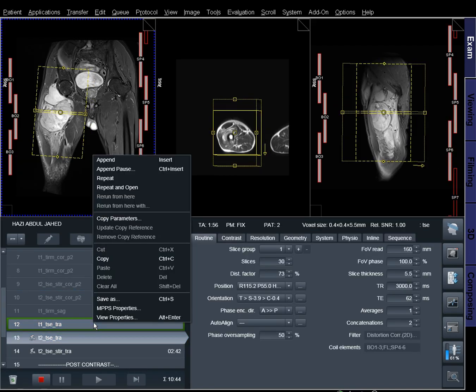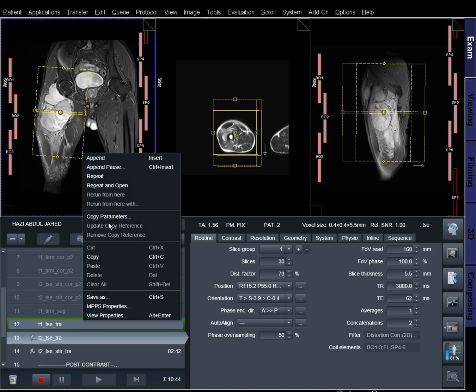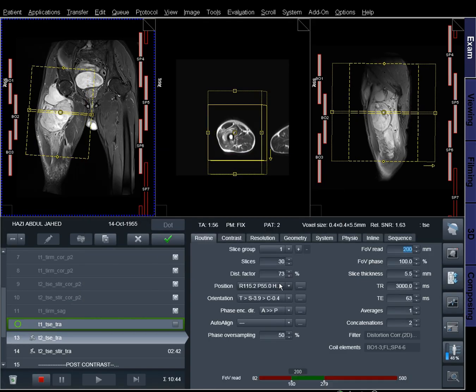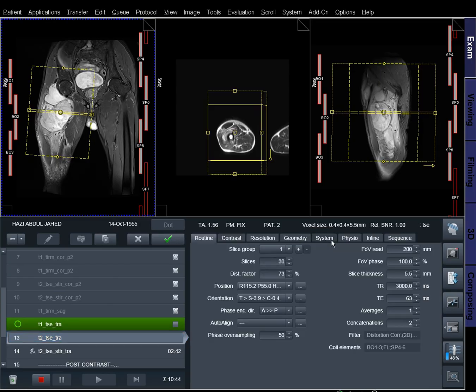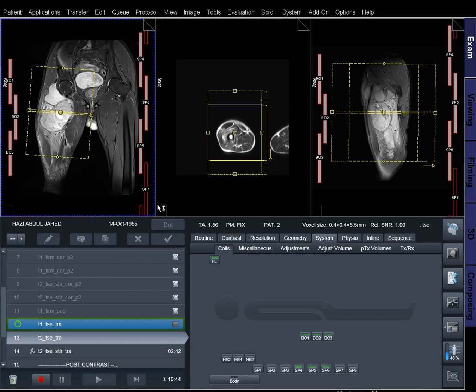Indications for MRI thigh scan. Marrow abnormalities, avascular necrosis, marrow edema syndromes, and stress fractures. Muscle and tendon disorders, strains, partial and complete tears, tendinitis, and tendinopathy. Congenital and developmental conditions. Neoplasms of bone, joint, or soft tissue.